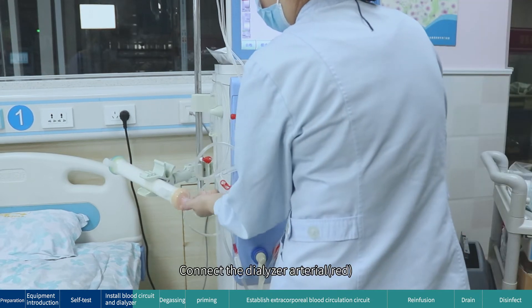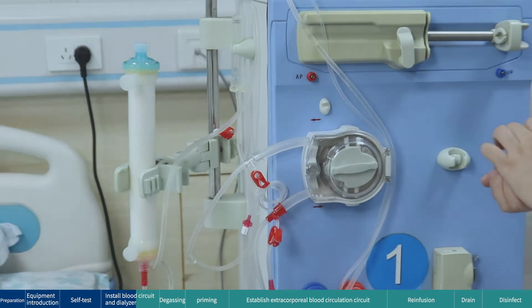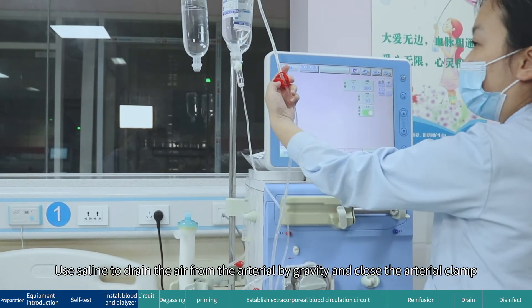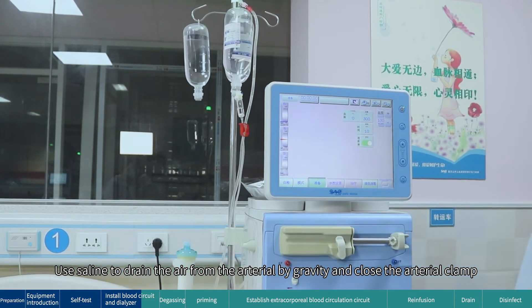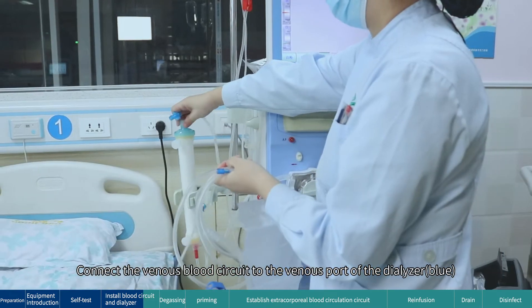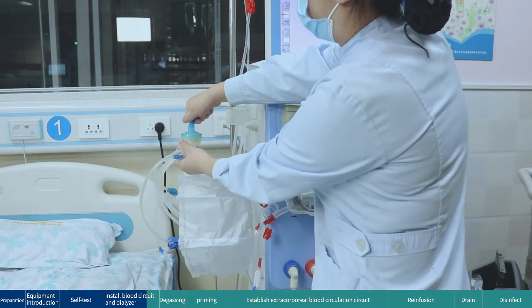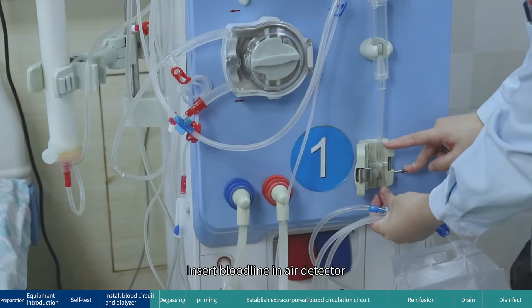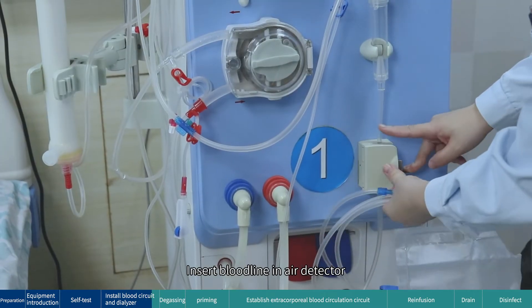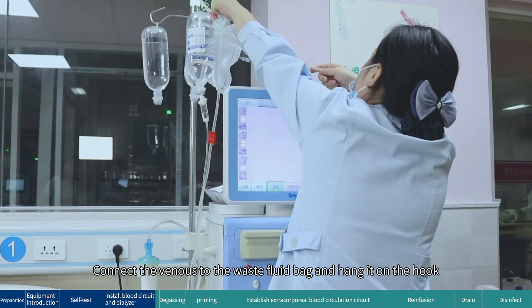Connect the dialyzer arterial port (red). Connect the venous blood circuit to the venous port of the dialyzer (blue). Insert the bloodline into the air detector, connect the venous line to the waste fluid bag, and hang it on the hook.